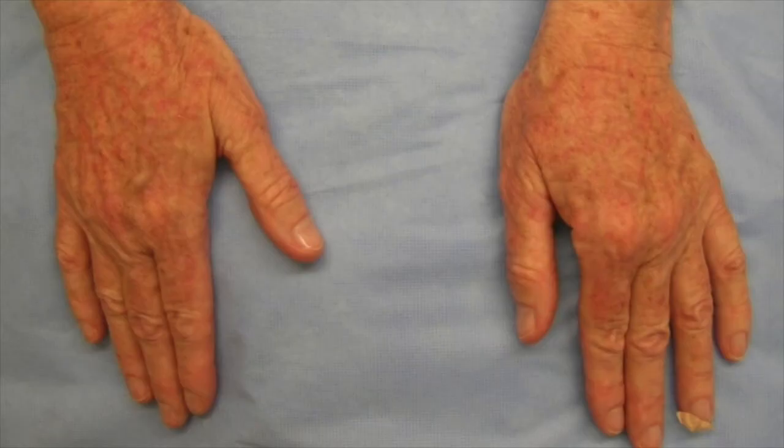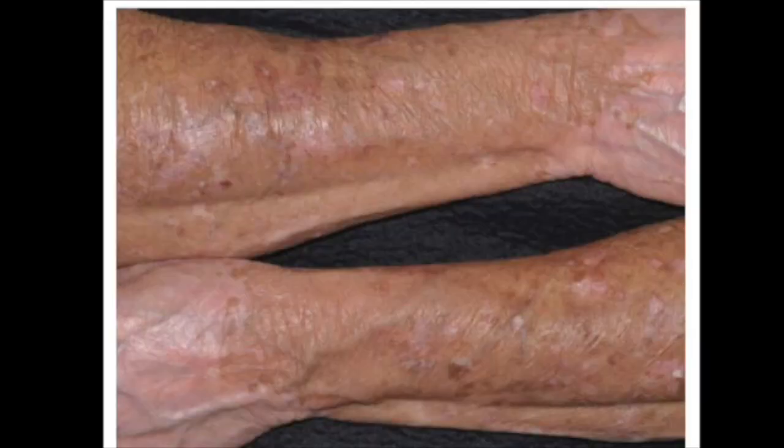Actinic keratosis is a precancerous lesion of the skin that is described to look rough, patchy, and scaly, caused by years of sun exposure. In this study, there were 7 patients with clinically diagnosed actinic keratosis who were enrolled in the study to use the Reflectance Confocal Microscope. The 7 patients included 5 men and 2 women from ages 47 to 75 years. The lesions of examination were on the hand of 3 patients, the dorsal forearm of 2 patients, and the forehead of 1 patient.